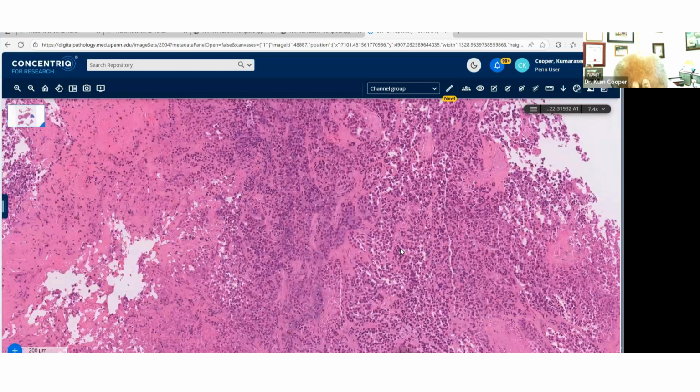And again, I share with you my approach and pattern: if I think NET or neuroendocrine tumors, because we occasionally do pick them up in metastatic bone tumors, then I'm doing all three: synaptophysin, chromogranin, and INSM1. So with the epithelial marker, I would do all three. Unfortunately, we do have that as well. So there is a NET that follows neuroendocrine, so we address that as well. Are there any rosettes or neurofibrils?